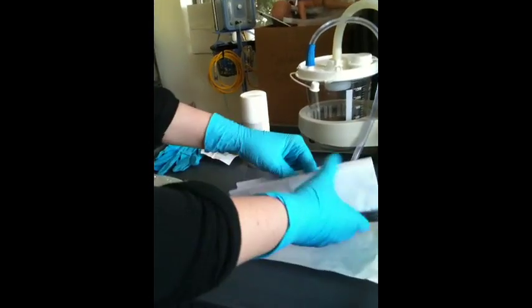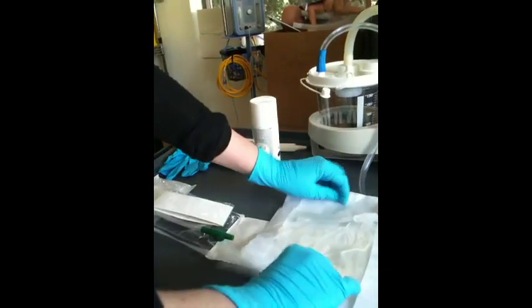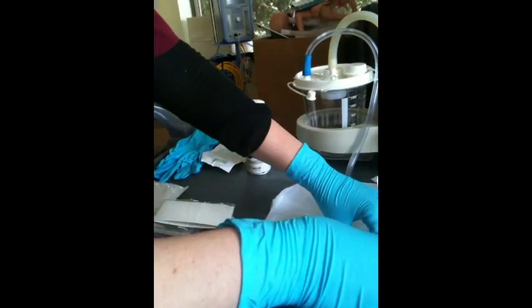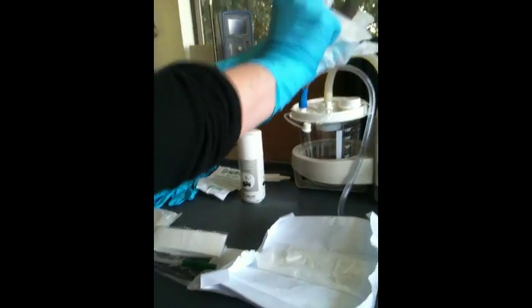On top of wearing our gloves, we're going to put sterile gloves on using a sterile technique.